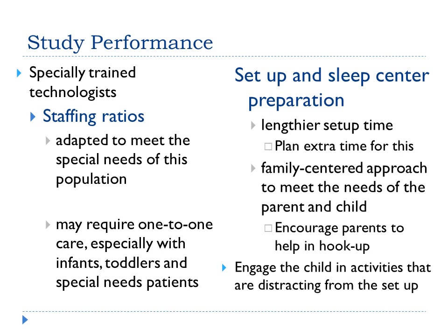For your setup and sleep preparation, expect a lengthier setup time, and go ahead and just plan extra time for this. Maintain a family-centered approach to meet the needs of the parent and the child. Again, encourage the parents to help in the hookup. And as you're hooking up, engage the child in activities that are distracting from the setup. Make it a game, make it something fun for them. Maybe they get to choose which color of electrode to put where, or where the next electrode's going to go, and whatnot. Let's go on to our next slide.